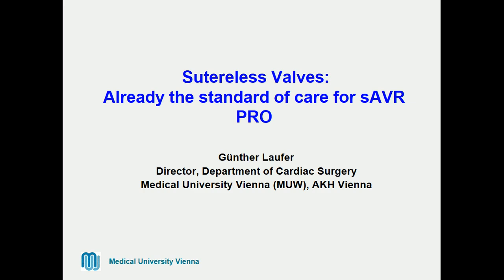Dear Nikos, dear Dr. Lea, ladies and gentlemen, at the beginning I would like to thank the Society for inviting me to give this talk on sutureless valves. I think the term sutureless is a bit of a misnomer. It should be stated rapid deployment valves, because sutureless per se by definition is only the Perceval valve. I want to cover in my talk not only the Perceval but also the Intuity valve, which has the same characteristic that both of them can be deployed rapidly into the aortic annulus.